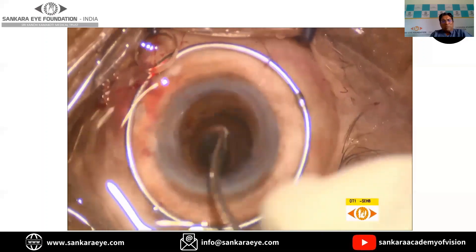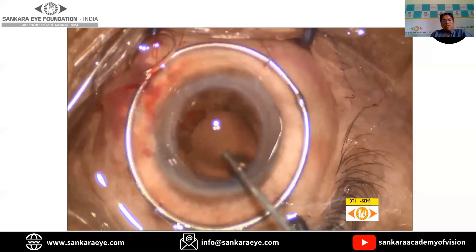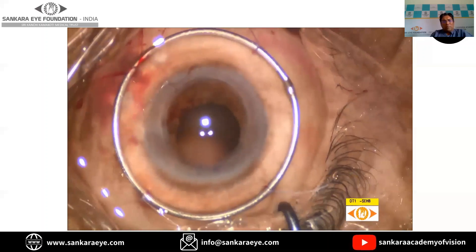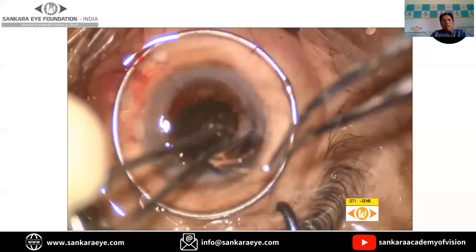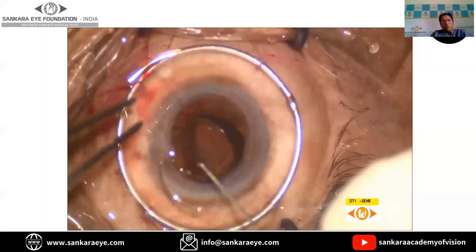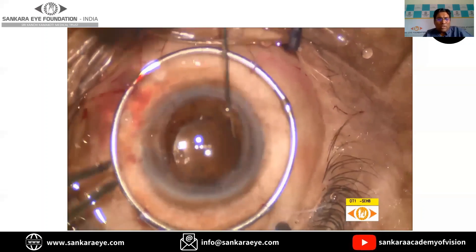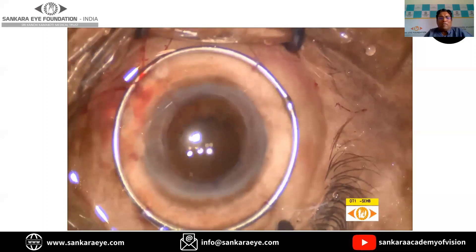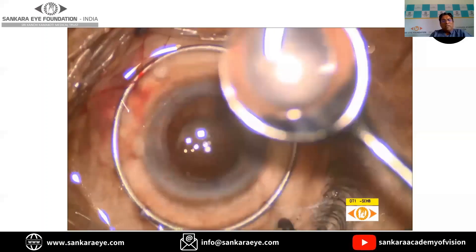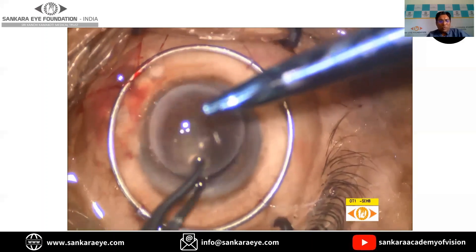Once all the cortex is removed, the intraocular lens is placed. In this particular case, we used a single-piece lens. Many times, if capsular support is weak or absent, we can use a retro-fixated iris claw lens or a SFIOL. Many surgeons put the lens at this stage, or they can also put the lens after the donor button is placed and after four sutures are placed. Once this is done, the donor tissue of the required size is placed on the recipient bed and sutures are placed.